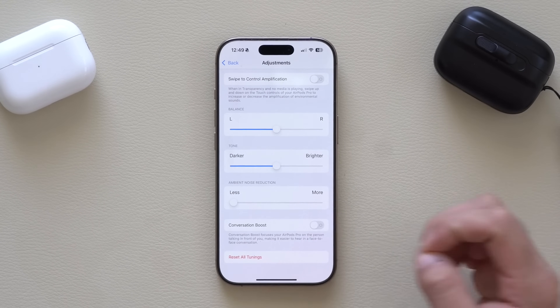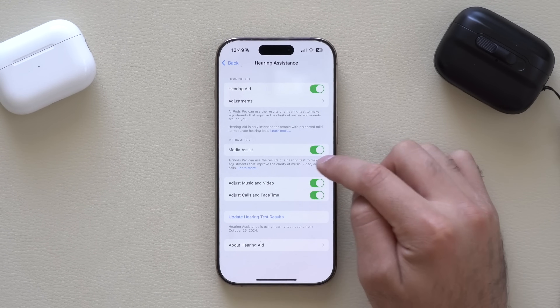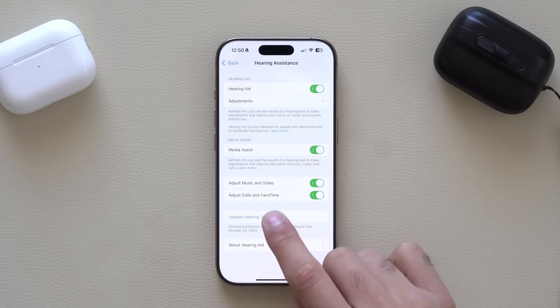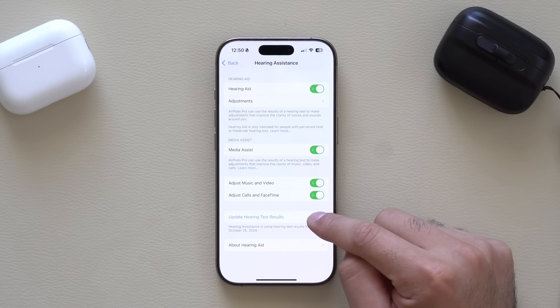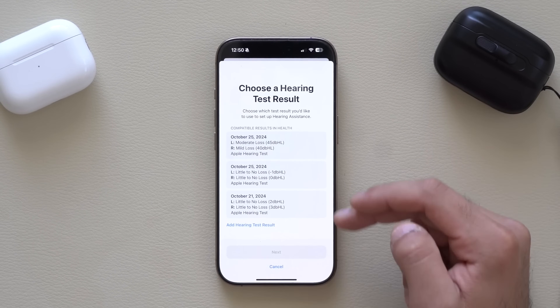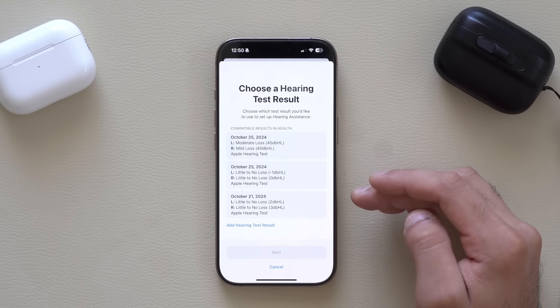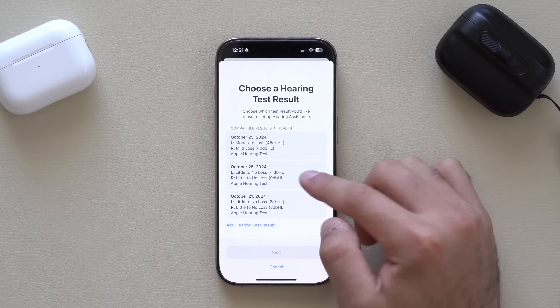If you go back to the Media Assistant, these hearing aid settings are also applied for viewing content or listening to media like podcasts, music, or YouTube videos, and it's automatically applied for phone calls and FaceTime as well. Where it says Update Hearing Test Results, this brings up your history of hearing test results — great for sharing earbuds with a spouse or others so you can switch between profiles.